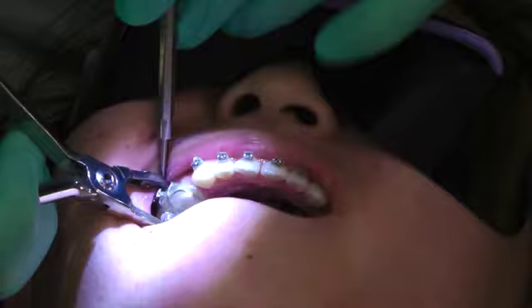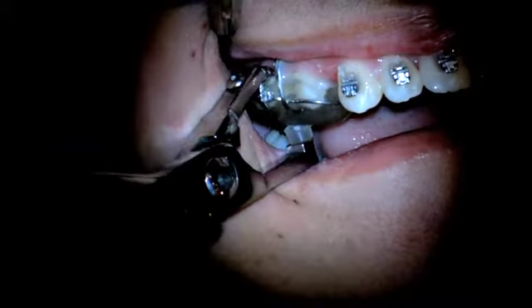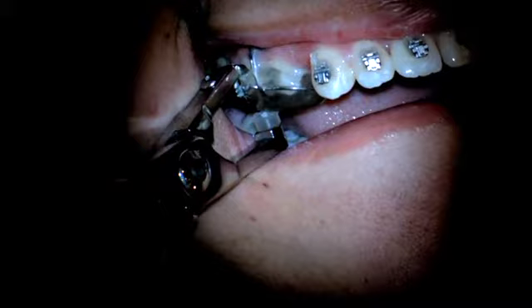The left side's out and the right side's about to come out. You can see how with this new design they're easier to remove than the old design we talked about — the acrylic doesn't crack. But you can see how good this three-in multi-band cement is, and that's why we'll never etch the teeth before you use it.